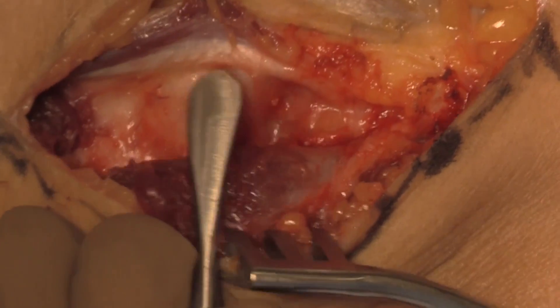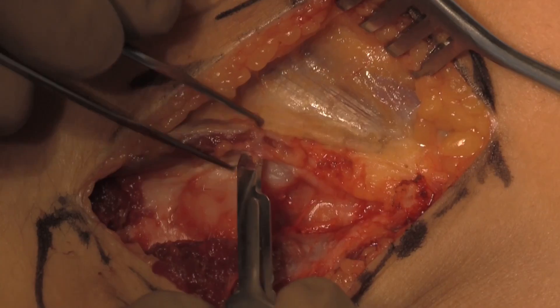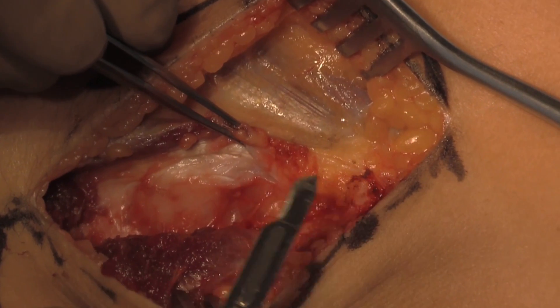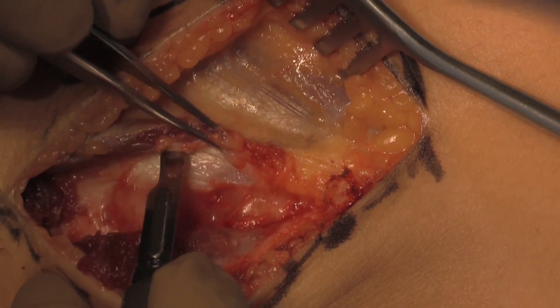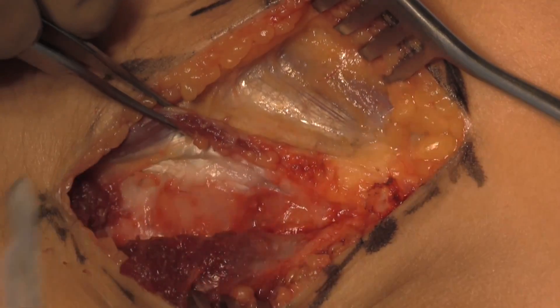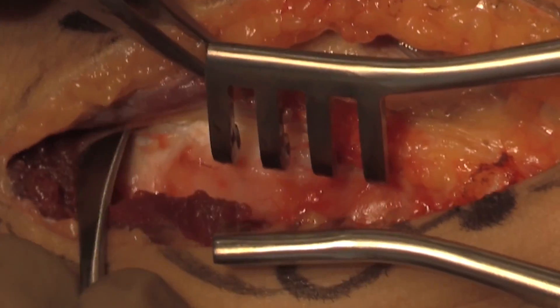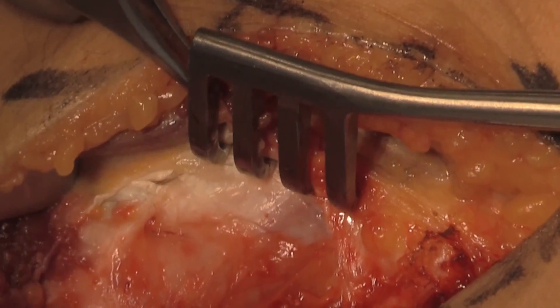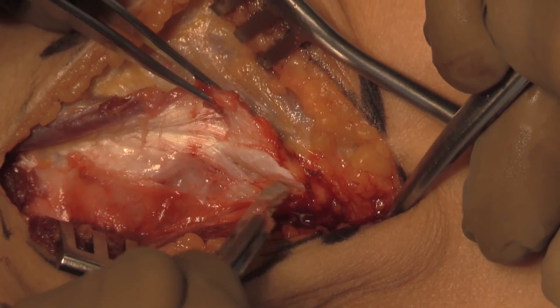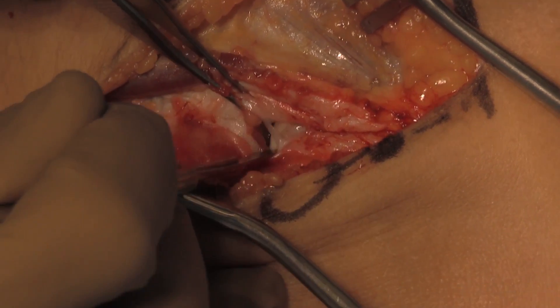We then further continue to dissect the muscle off the capsule. Here we see the radial head as we continue to expose both the annular ligament and the capsule. Dissection proceeds anteriorly with elevators used to further define this plane and self-retaining retractors are placed. The incision is carried proximally up to the level of the lateral epicondyle and the capsule is incised over the radial head, extending proximally and distally. The joint is seen here.